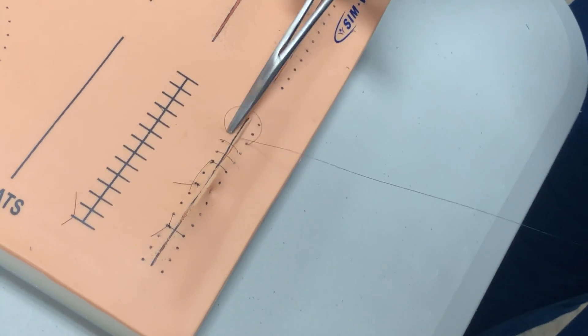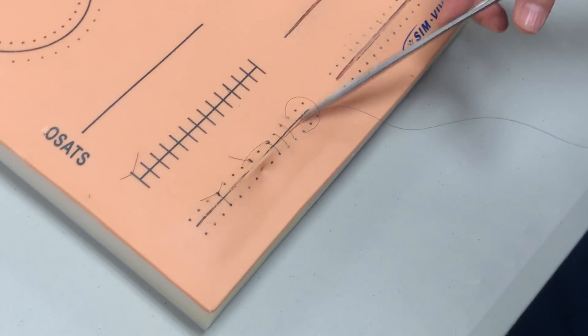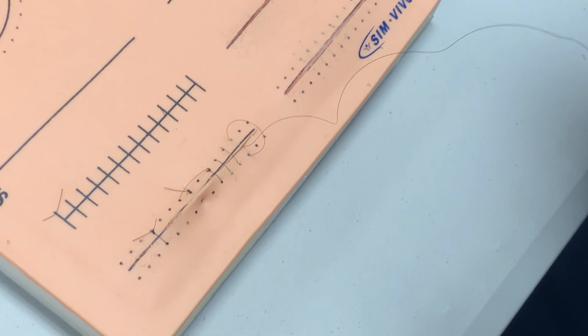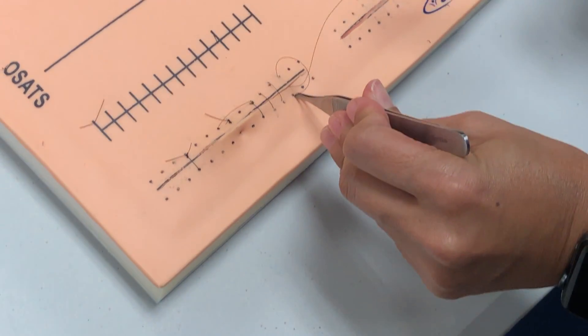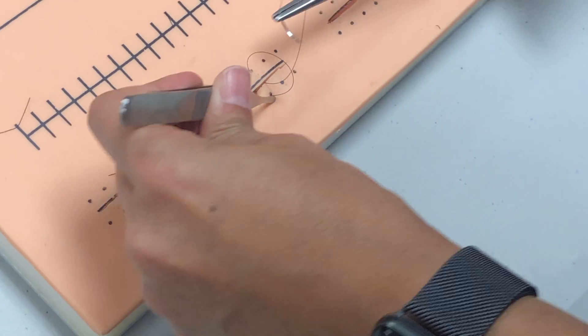And on this one, I'm going to leave a little loop. This is my last one, but I can't finish in the middle. I have to come out on the other side. So on this last one, I'm going to come out closer, right here, just so it looks neater. So on this one, I'm going to come through. I'm going to come out about right there.